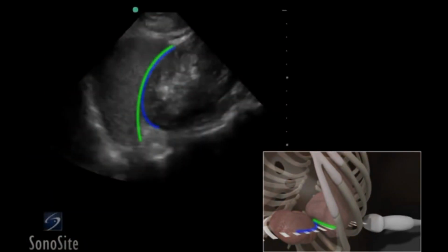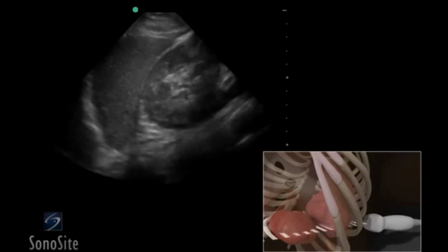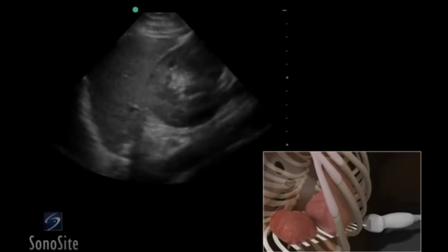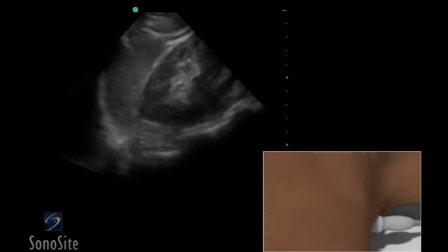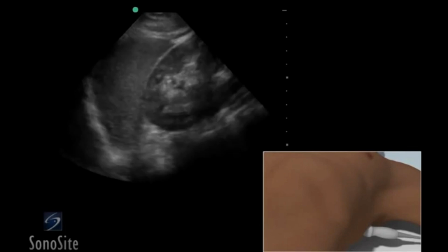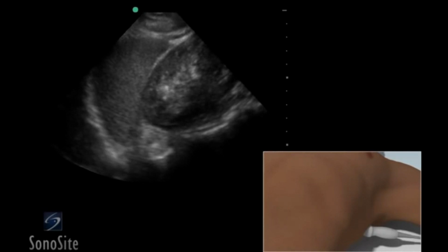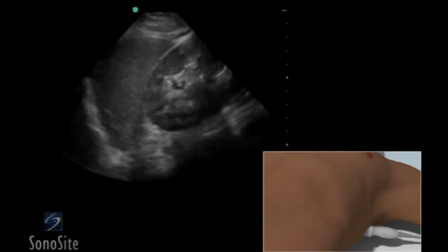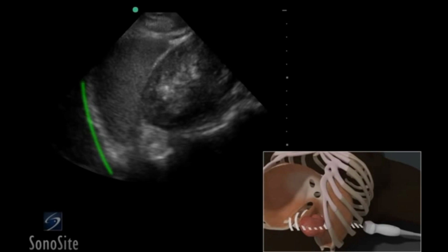To evaluate the entire area of the splenorenal recess for free fluid, sweep the transducer from an anterior to posterior position. Carefully examine the splenorenal recess and subphrenic space. Fluid will appear dark or anechoic. If it is difficult to visualize the splenorenal recess, a deep inspiration will move the diaphragm and other structures in this area down and below the ribs for easier access. Sliding the transducer in an upward direction will visualize the diaphragm and pleural interface.